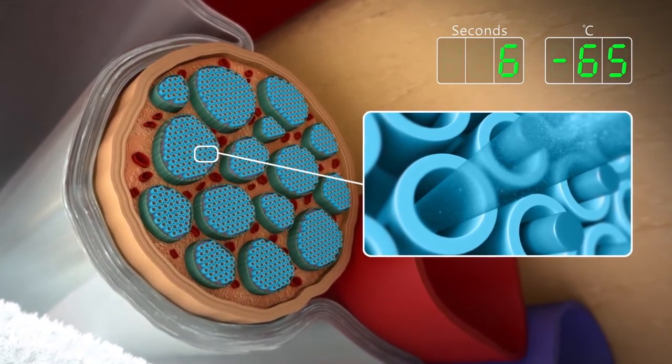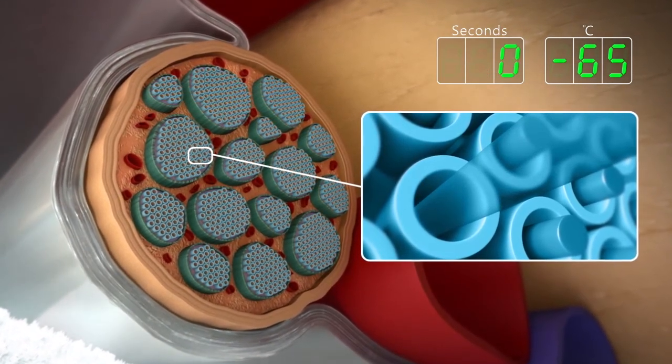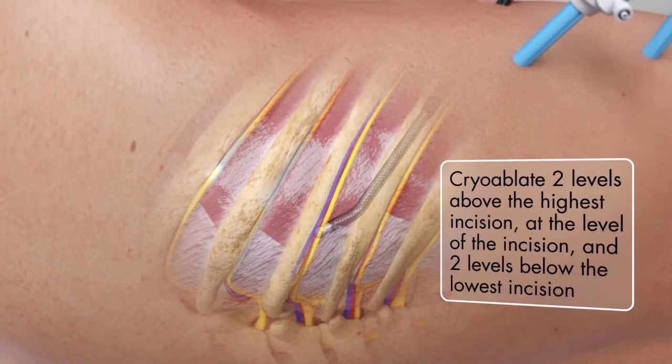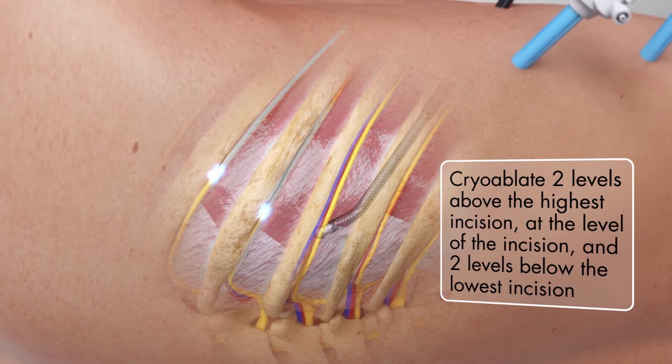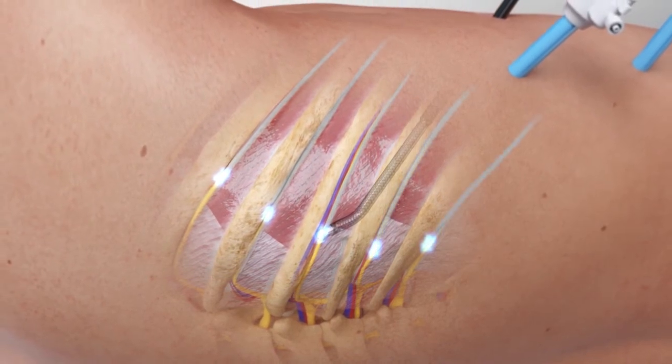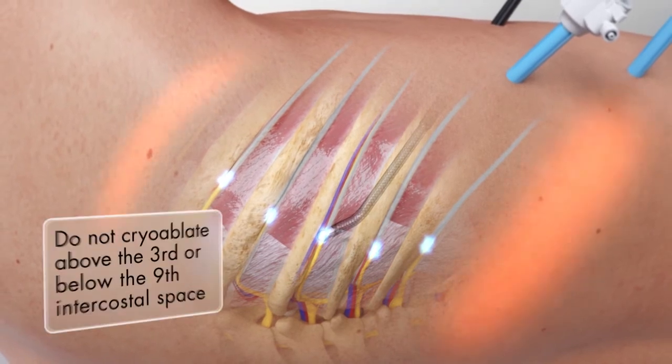Cryo ablations are performed two levels above the highest incision, at the level of the incision, and two levels below the lowest incision.